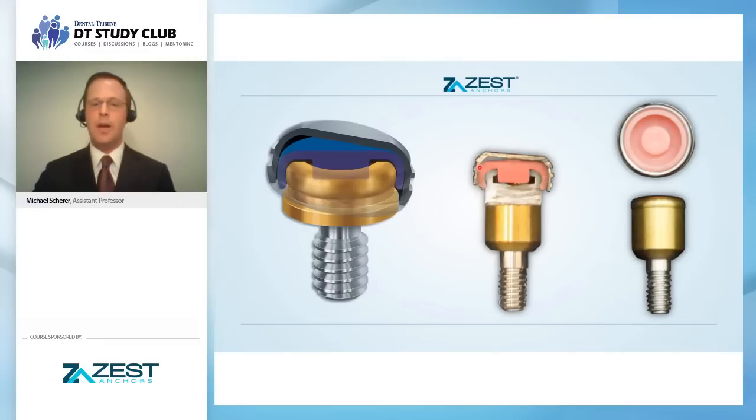And I'm going to go through and just accelerate that. And you can see here, this allows for resiliency of the attachment. The resiliency is inside of this space. But what's key here is that if that cap were not there, this is just showing you how the locator male insert is attaching to the attachment. It's rigidly attached to the attachment, where the locator housing cap is actually rotating on top.